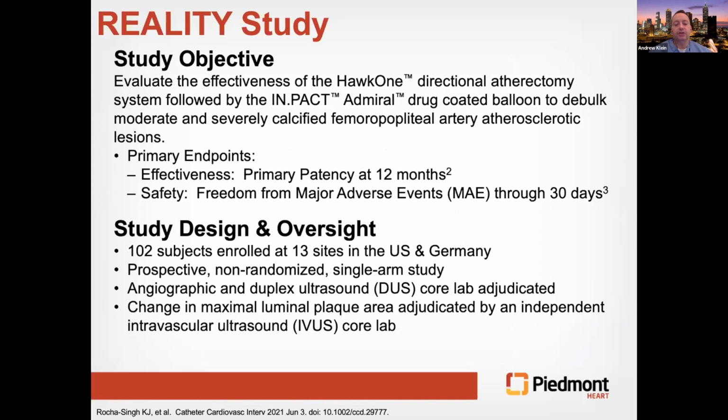Now, this was an extremely hand-selected group of operators. I really wanted to be in this study, but I just wasn't on the cool kids list. This was an incredibly detailed group of the world's best experts of directional atherectomy. And I bring this up because if you look at the adverse events or the procedural complications, even the best experts in the world still had complications.